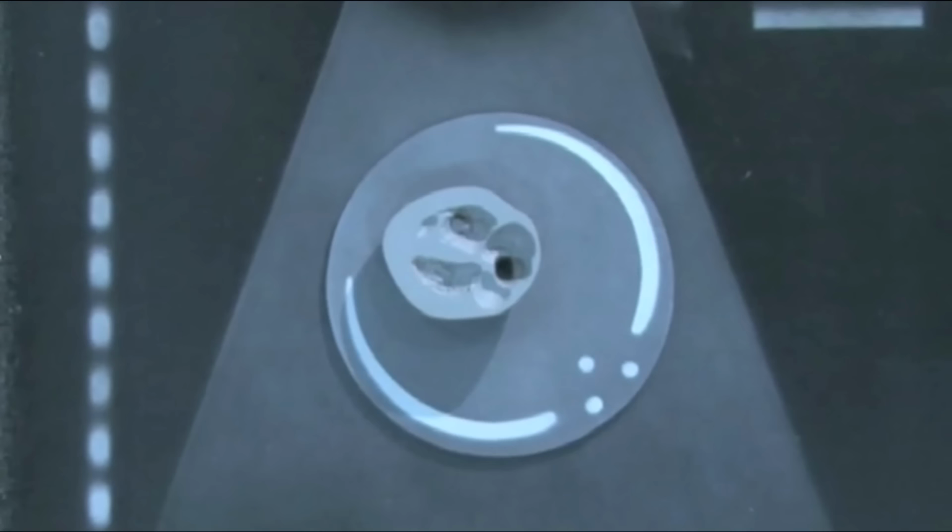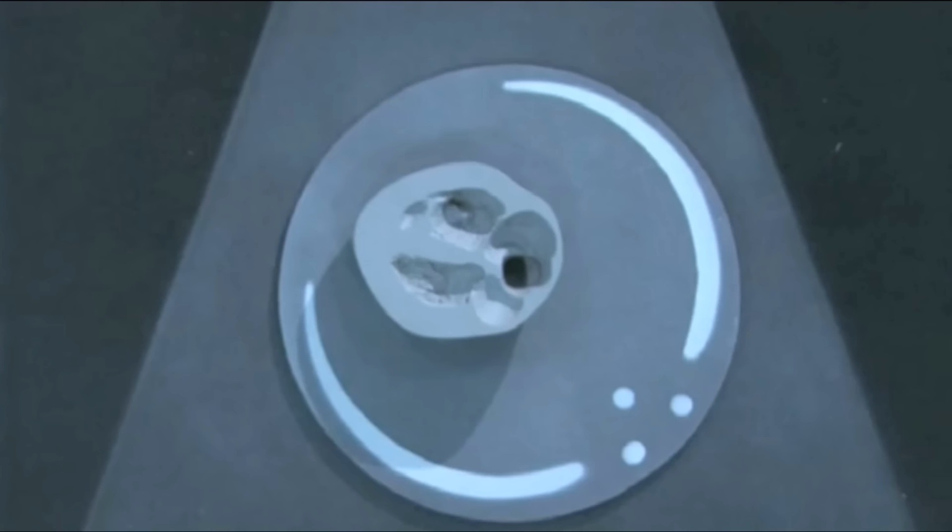When you look at these features on the model, in the image you can see the baby is lying with its back down and towards the right, so its left side is downwards, its right side is slightly upwards, and the feet are in the screen with the head out towards us.